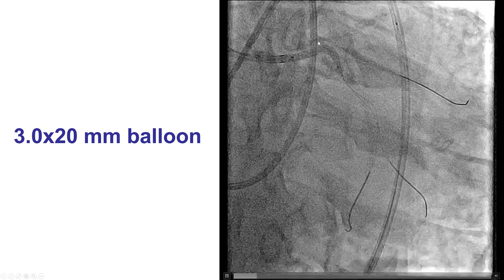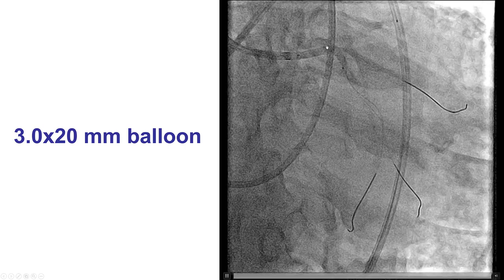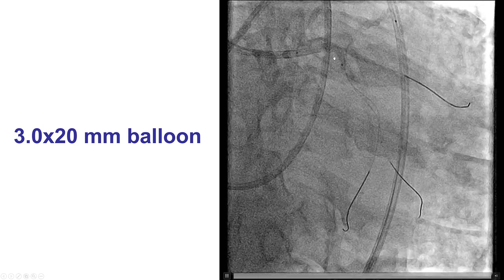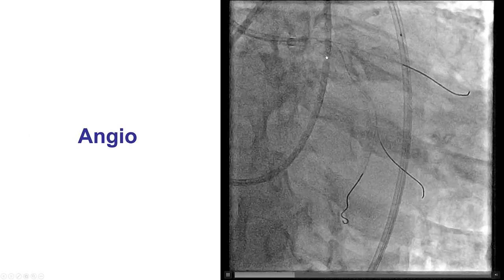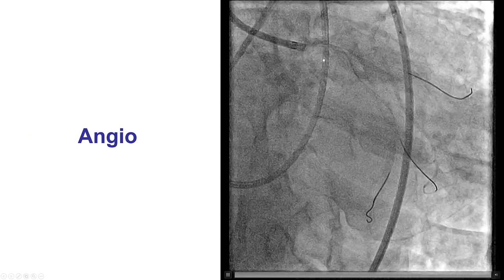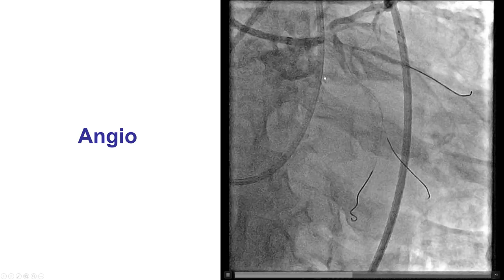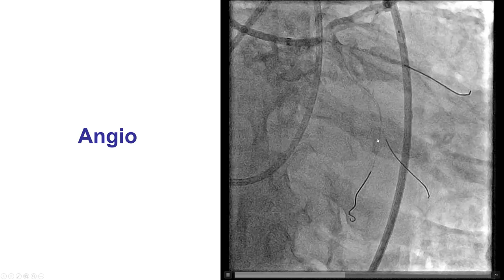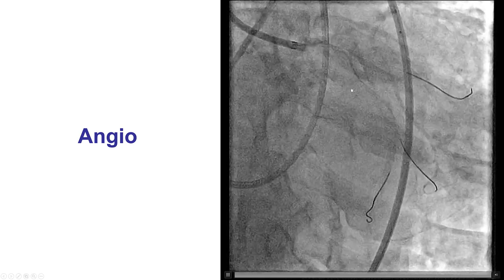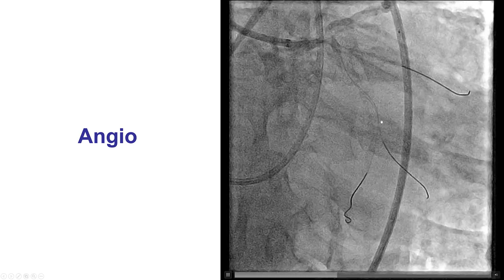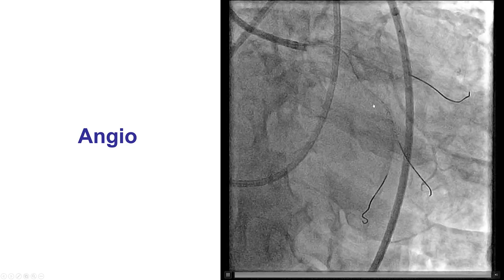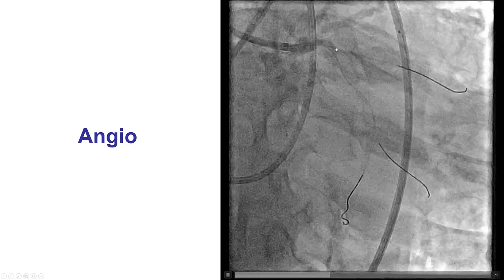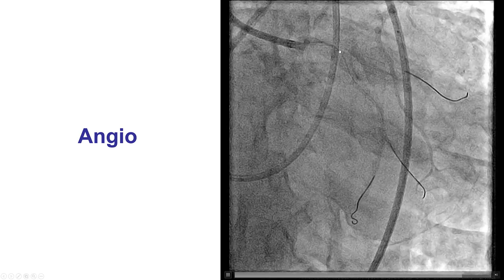Given the significant stenosis in the left main and the intermittent pressure dampening for which we had to engage and disengage the guide catheter, we performed balloon angioplasty of the left main. That improved the stenosis, although we still have a significant lesion at the distal bifurcation. We have some better flow, but still relatively slow flow into the circumflex.